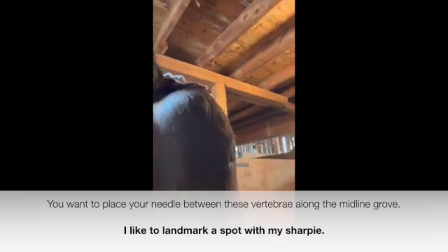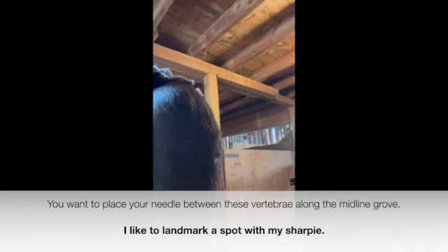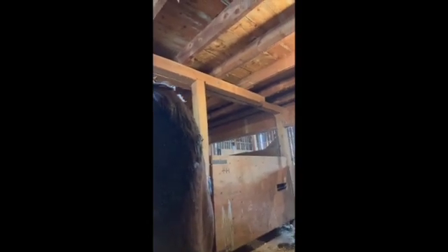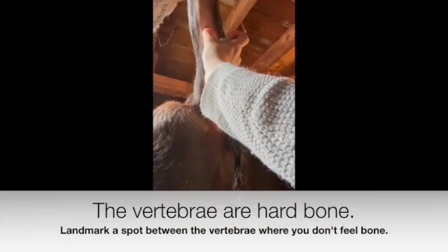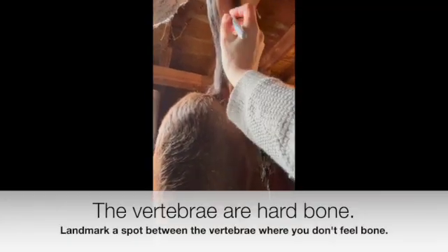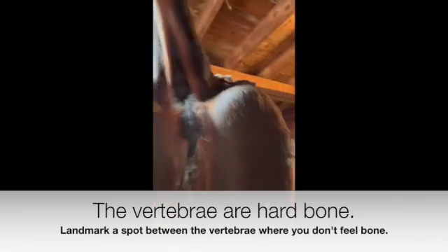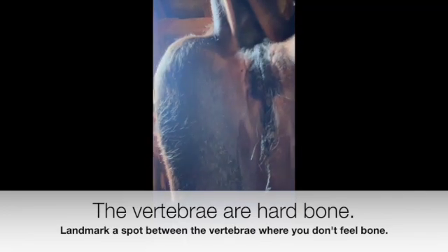I have a sharpie here that I wanted to use for landmarking, just so I have an idea of where I want to put my needle if I lose my place. I'm going right there. Got my alcohol wipe — wipe it off — and I can still see my little mark.